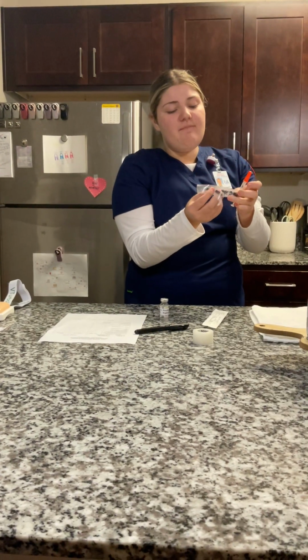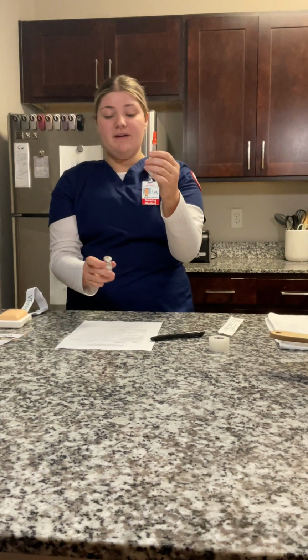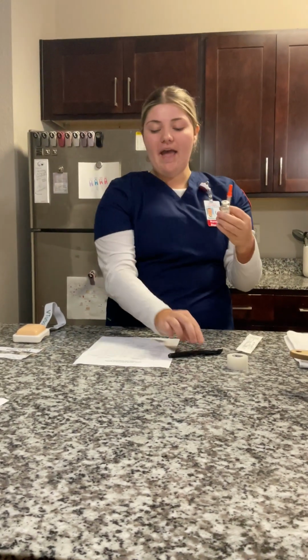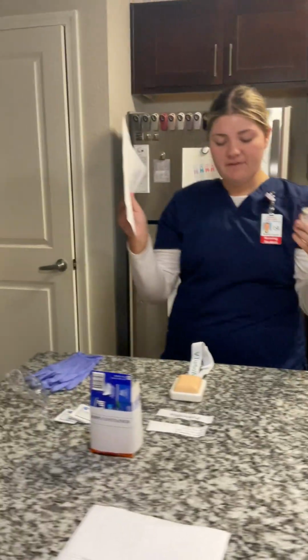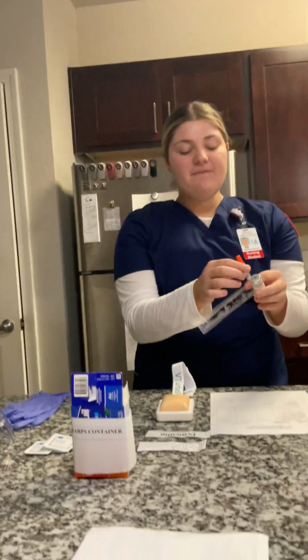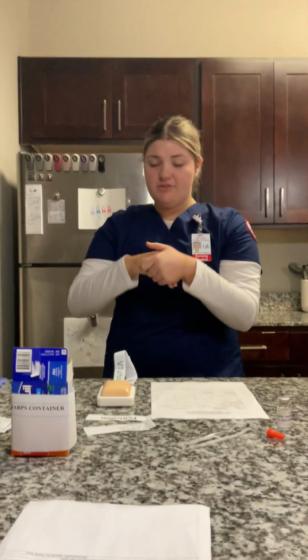So now that I have my label done and the documentation's done, I'm going to take my syringe, my vial, and my MAR to my patient's room. So we're going to come over here, and the first thing I do when I get into a patient's room is always do hand hygiene. So I will do that.